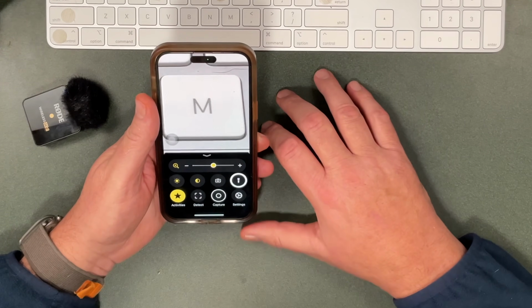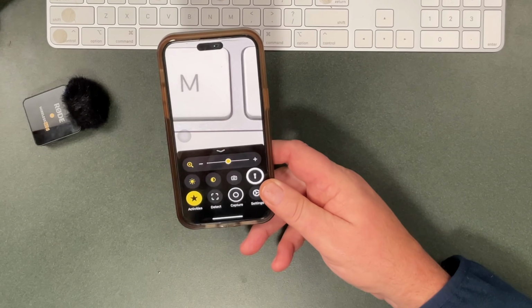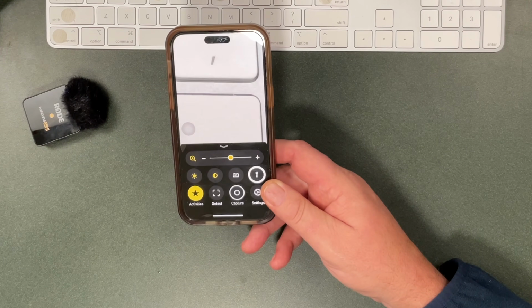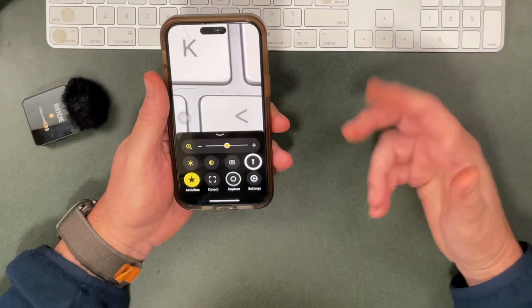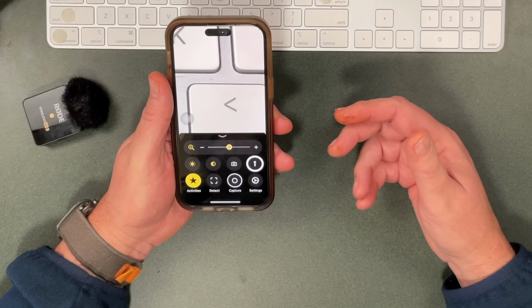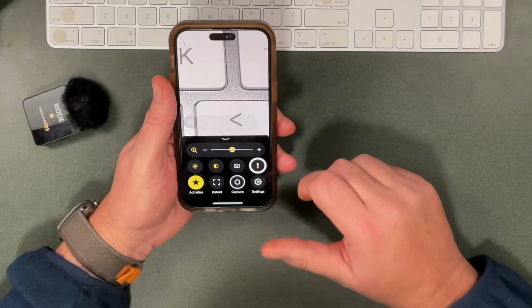Flashlight off button. I can turn the flashlight on if I need to use it in a dimly lit environment. And that comes in sometimes, it comes in pretty handy if I am in a big box store and I'm trying to read a label and it doesn't want to pick it up very well. I can turn the light on because it'll tell you if it doesn't have enough light. I can turn the flashlight on and get a little bit closer, and then that makes it all better. Flashlight on 100. Flashlight off.